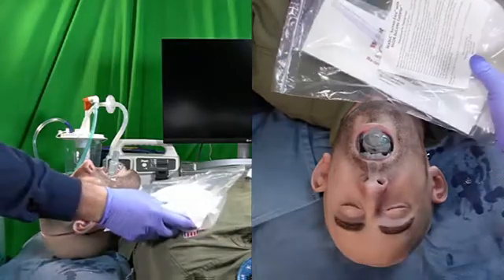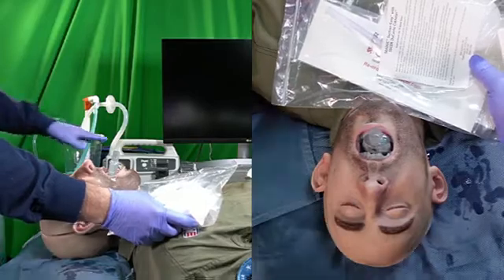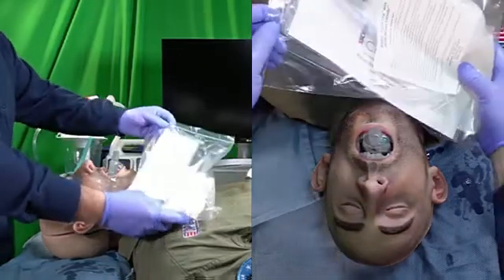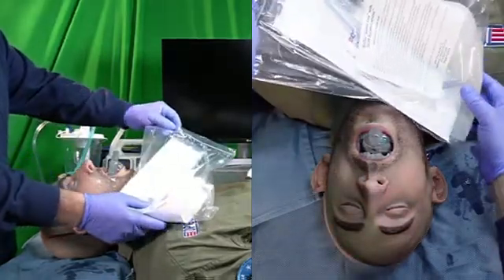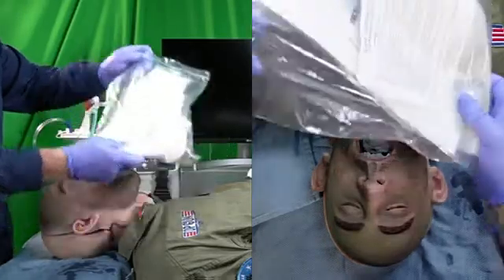What I want to introduce here is the use of a manual suction device in lieu of an electronic suction device. We're going to look at something called the SeaDuck, which is a combination of a device called a SuctionEasy with a SCORE DuCanto catheter.